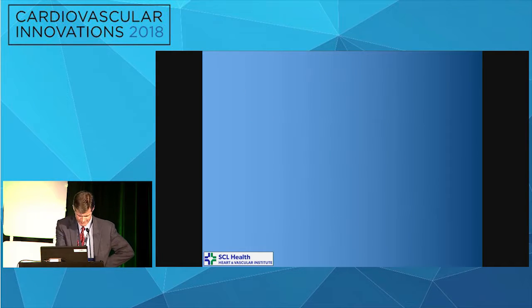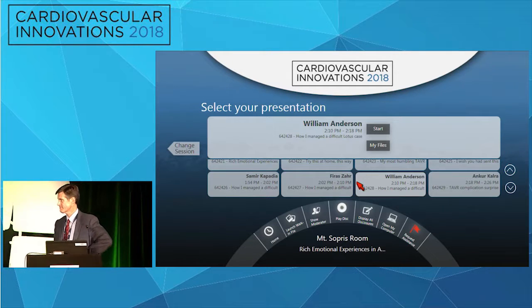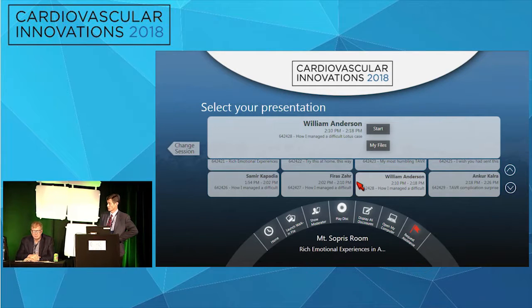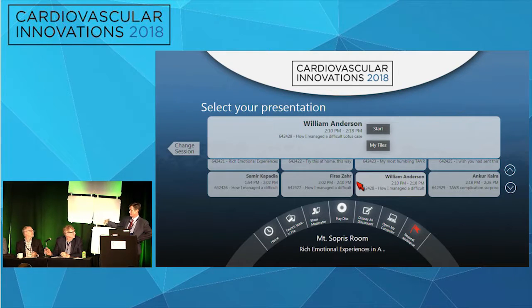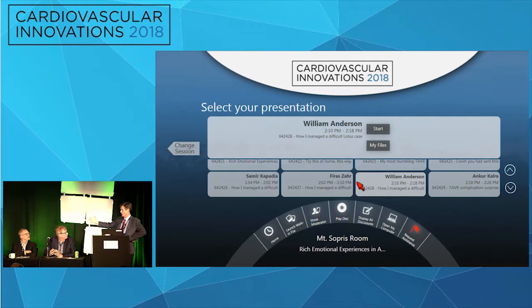I would just say, I'm not sure the height of your Sapien, whether it be a little lower, is going to change that, right? You have open cells up there. That's a leaflet length calcification, because if you dropped it way low, you don't think that stiff thing's going to... No, I would totally agree. And really, just trying to draw some parallels to what we're thinking about from the literature as DCO, I don't really think this was DCO. I think it was just uncovered at a later time because of clinical events.